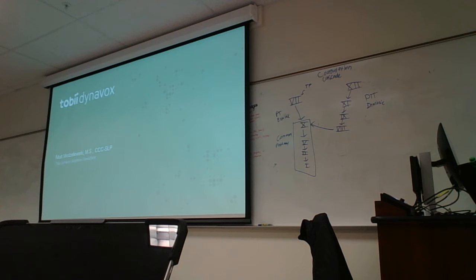So that's where my AAC interest began, and actually first began in our graduate program as a course such as this, that we had one course that we were able to try different devices and practice with them and try them on our own, which we'll be able to do today.